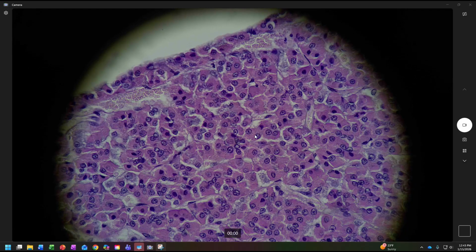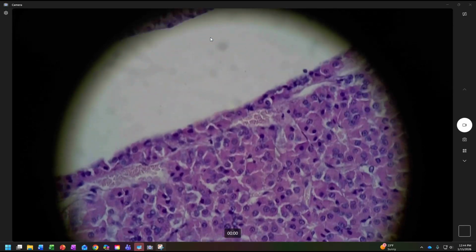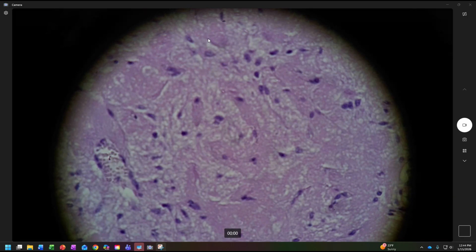There's a nuclei. The cytoplasm kind of stains a little more dark. So again, this is not anything that I would ask you to repeat on an exam, but I just want to show you this is how you can tell the difference between the anterior and posterior pituitary. So let's go over this little gap here and back into the posterior pituitary gland.